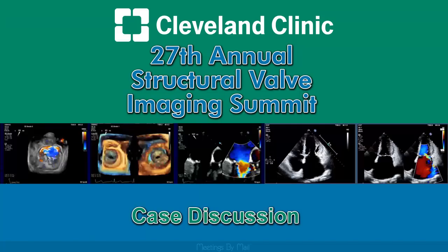Fair enough. So to those on the panel, Steve. I just wanted to comment. It's a beautiful case and a very nice result. We've had several similar plugging anterior leaflet perforations, one combined with the mitral clip just like that, and we did it just the order the other way around. The clip first, and that actually stabilizes the anterior leaflet and makes the plugging a little easier.